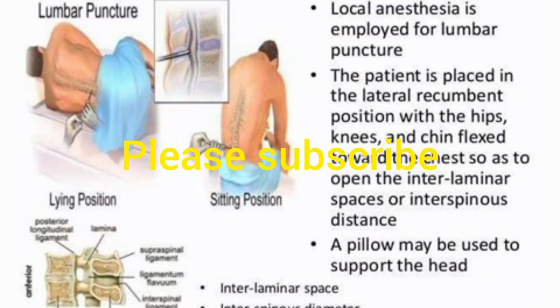How to perform this lumbar puncture? Local anesthesia should be given before the procedure. The patient is placed in a lateral recumbent position with the hips, knees and chin flexed towards the chest, so as to open the interlaminar space or interspinous distance. A pillow may be used to support the head. This is the position preferred for the lumbar puncture.